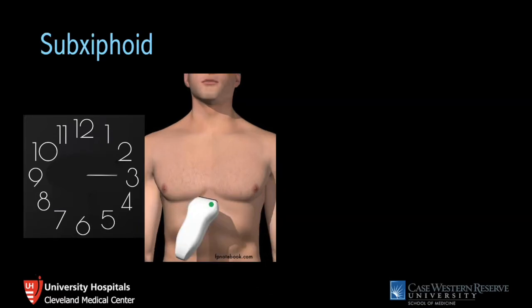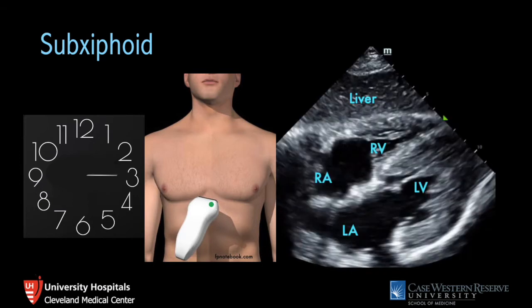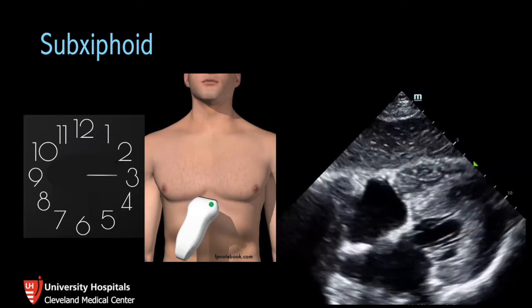Moving into the subxiphoid region, keep your probe marker pointing toward the three o'clock position, with your probe just under the xiphoid process in the epigastrium. It helps to hold your probe with an overhand grasp and apply a lot of pressure — more so than with the other views. You'll actually see the liver in this view since you're in the abdomen looking up at the heart. If you have difficulty getting this view, such as with a lot of bowel gas, slide your probe slightly toward the patient's right — which seems counterintuitive — but use the liver as a good acoustic window, and it generally optimizes your image.